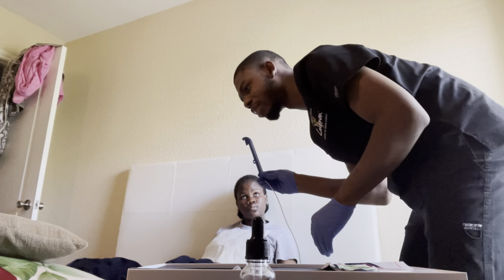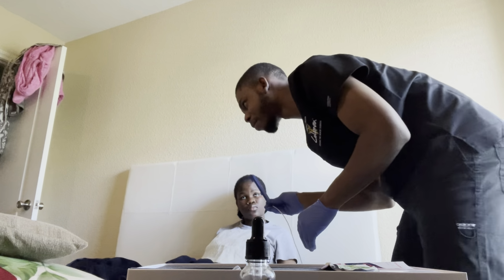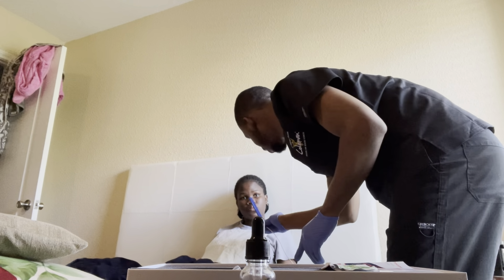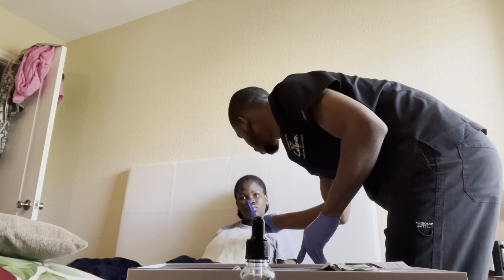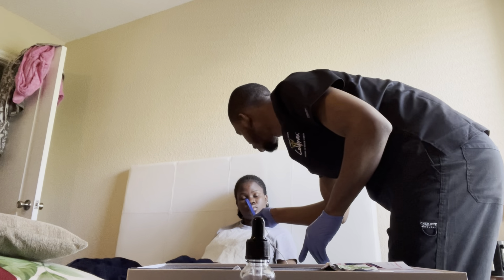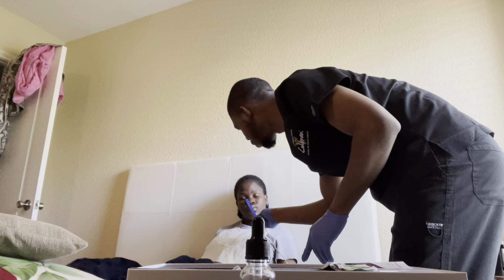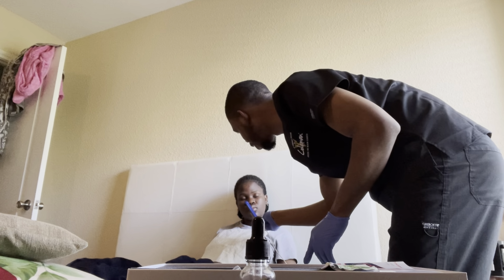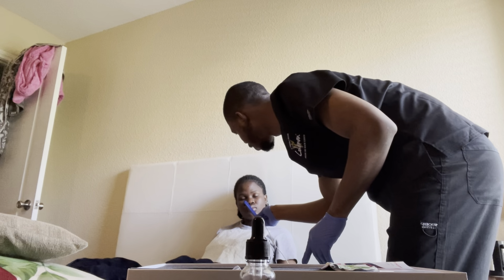I will take the suctioning catheter and put it through one of the patient's nares. Now I will be suctioning the patient. The catheter is inside.